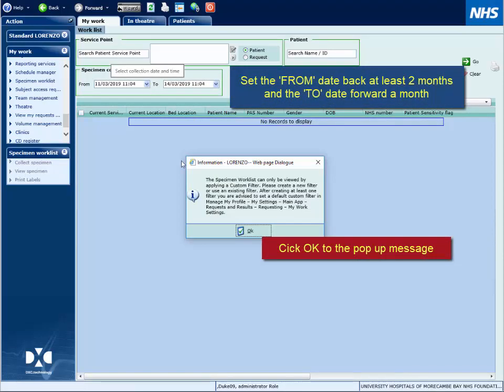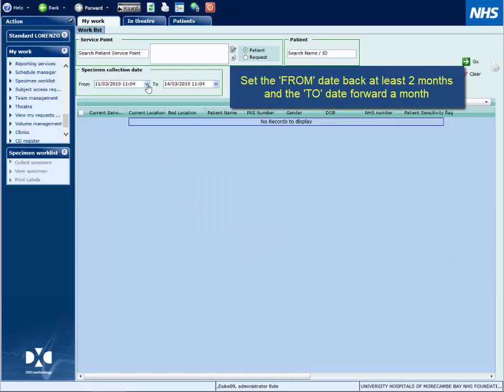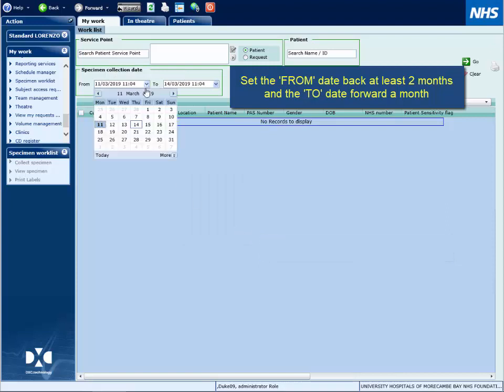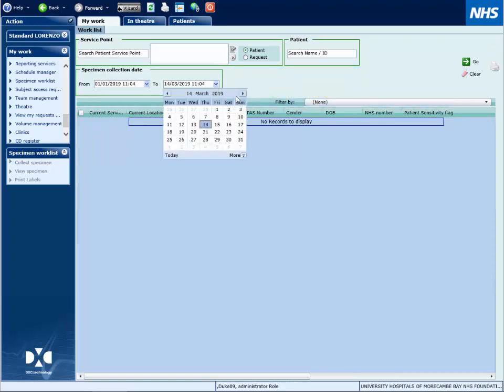First, set the from date back a couple of months and set the to date forward one month. This will ensure you pick up all patients with active requests.